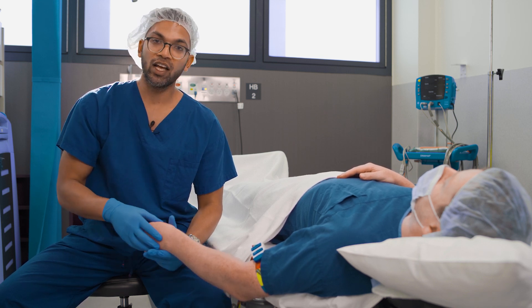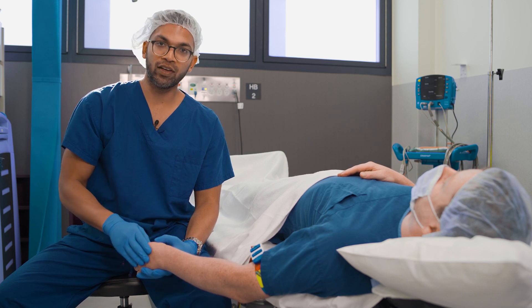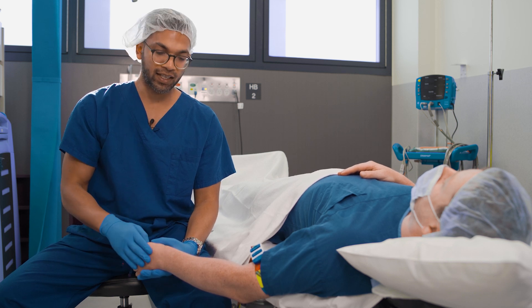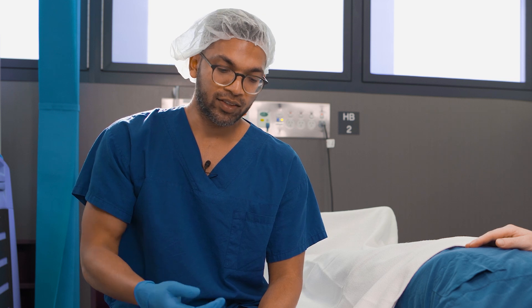The forearm is kind of an advanced area because you can't always get the low angle that you require to really get those difficult cannulas in.